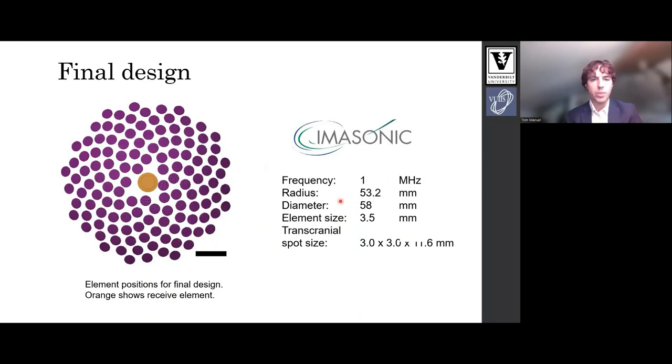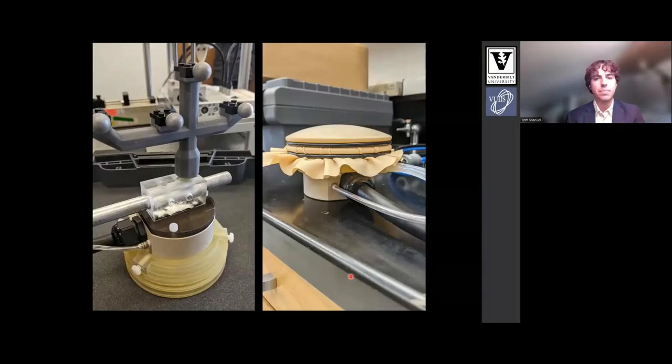Here's our final design: 128 elements, 53 millimeter radius of curvature, with an expected spot size of 3 by 11.6 millimeters. It was fabricated by Imasonic. This is what the array looks like with optical tracking gear and a water coupling case we built for it — here's the case, here's the coupling, and here's the optical tracking gear.